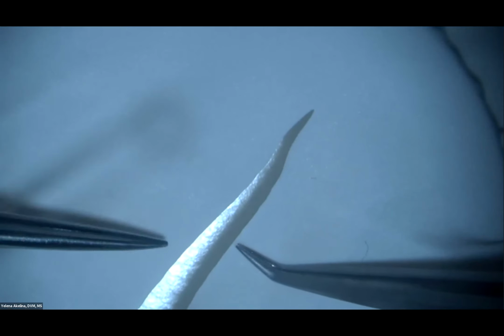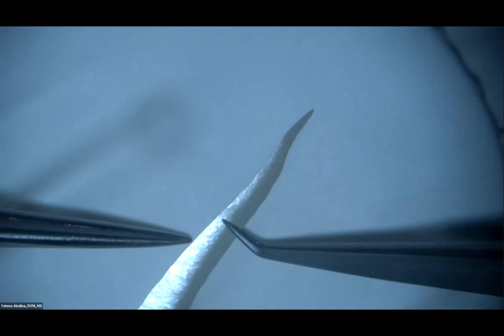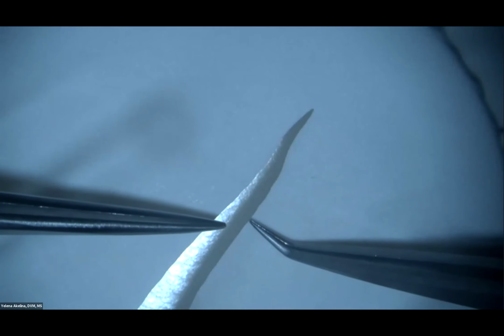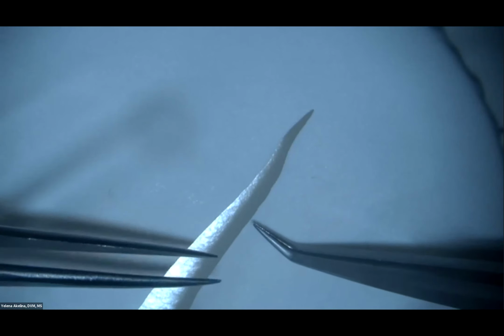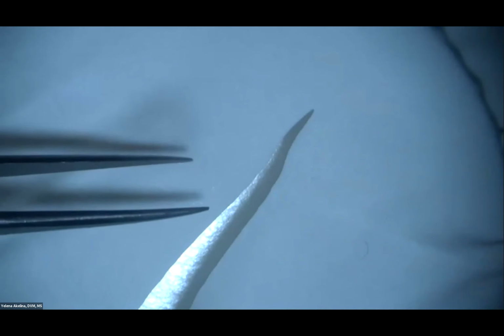And she can zoom in a little bit on my hand position. You're holding instruments with a pencil grip like this, and the hands on the surface. Okay, so this you adjust the hands so they're more supportive and they're not moving, so you have less tremor.